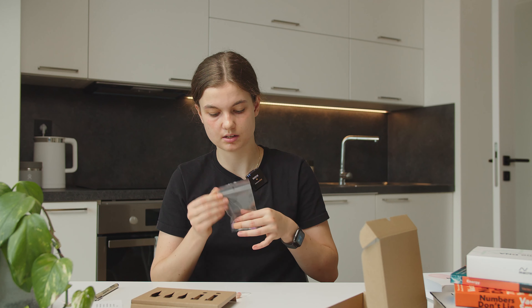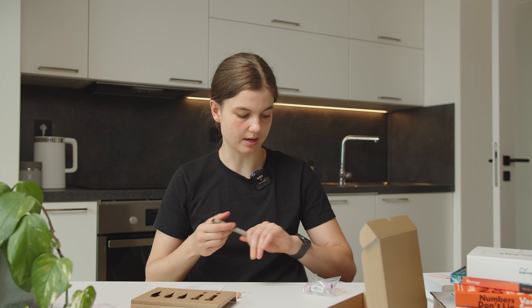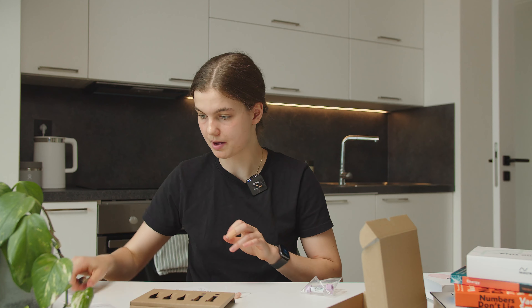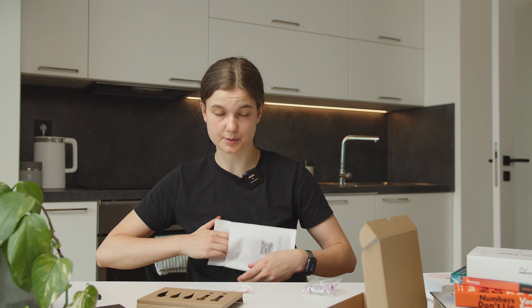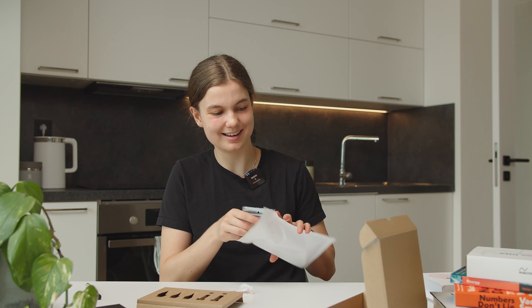I'll fill in my lab card. Then I place both vials into the shipping envelope — it has a prepaid shipping label — and I'll send it off to the lab. And yes, that's the whole process.